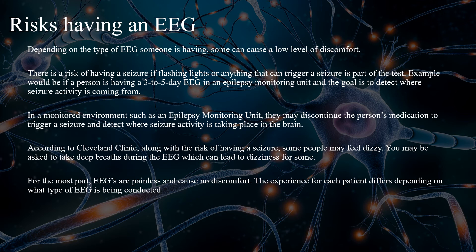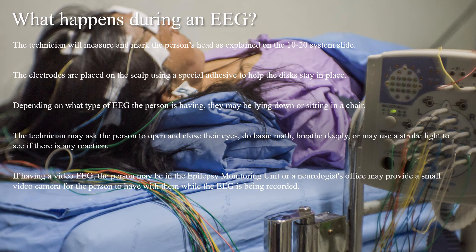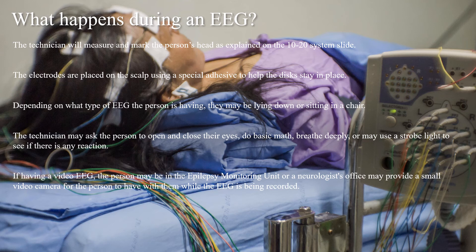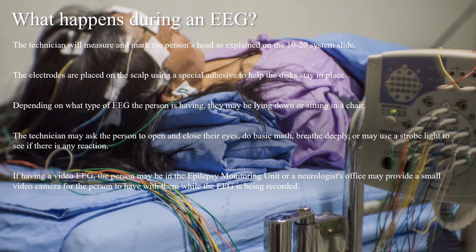The experience for each patient differs depending on what type of EEG is being conducted. In preparing for an EEG, the technician will measure and mark the person's head as explained in the 10-20 system. Electrodes are placed on the scalp using a special adhesive. Depending on the type of EEG, the person may be lying down or sitting in a chair. The technician may ask the person to open and close their eyes, do basic math, breathe deeply, or may use a strobe light to see if there is any reaction. For a video EEG, a small video camera may be provided while the EEG is being recorded.